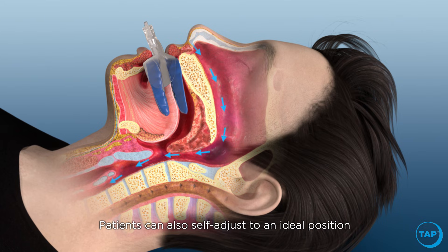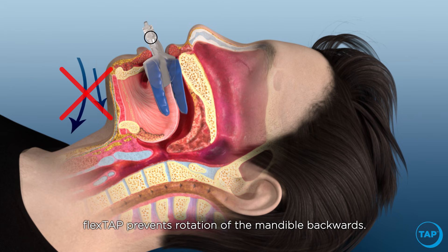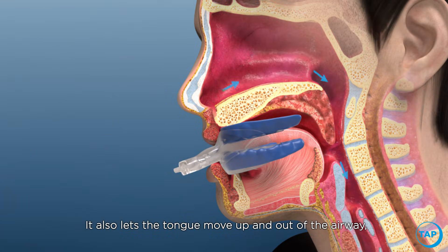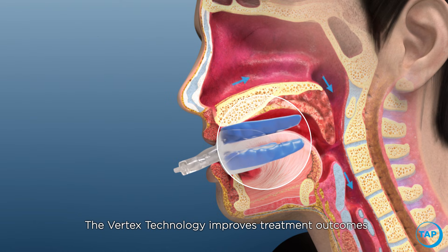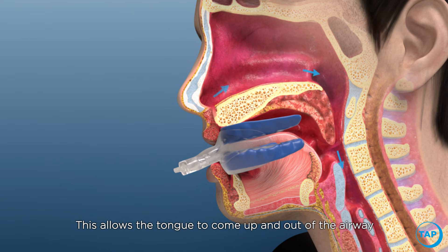Patients can also self-adjust to an ideal position with the trays tethered outside of the mouth at the midline. Flex Tap prevents rotation of the mandible backwards and lets the tongue move up and out of the airway. The vertex technology improves treatment outcomes by creating space in the mouth both vertically and horizontally.